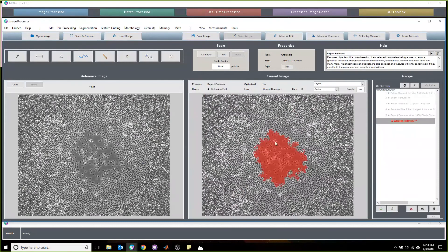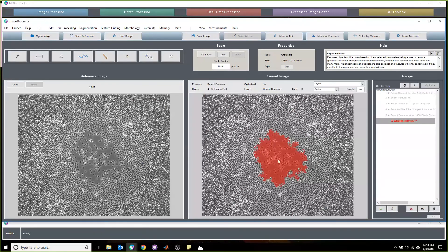I would still recommend going back through and doing some quality assurance in the batch process using our process image editor, but this is a recipe that is fairly impressive. Good job.